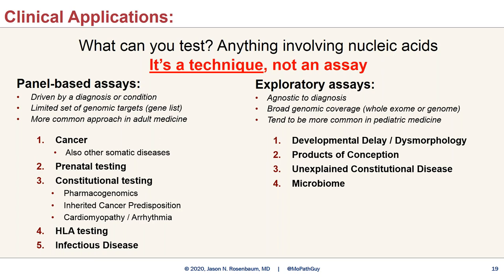And the microbiology application in this context, the analogy to infectious disease, would be microbiome testing, which everybody tells me is 5 years away, and they've told me that for the last 7 or so years. And then there are other ways to deploy NGS or MPS-based assays that we're not going to go into great detail on, but they don't necessarily fit neatly into either category.